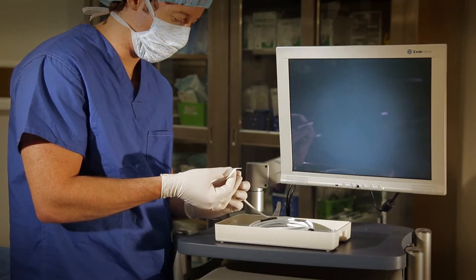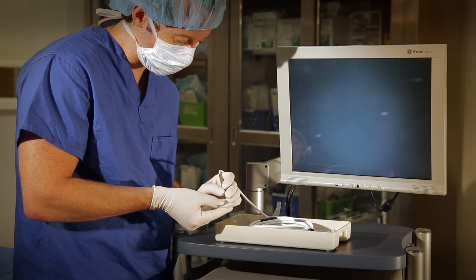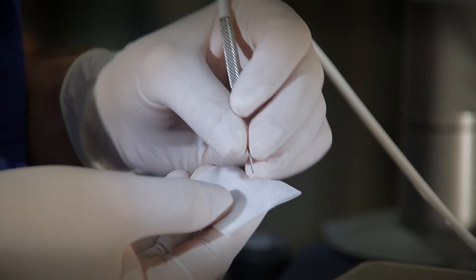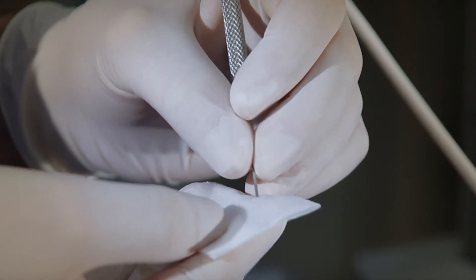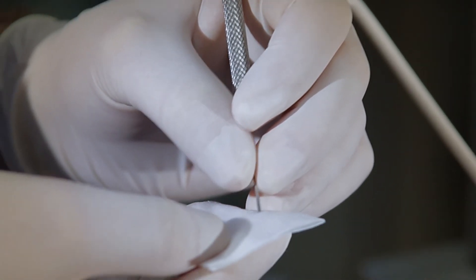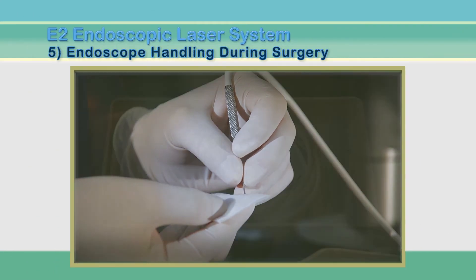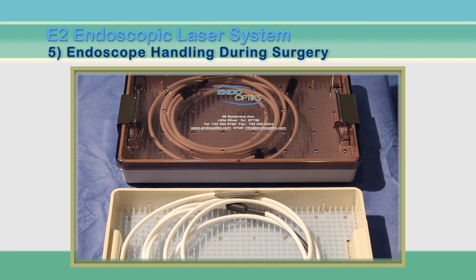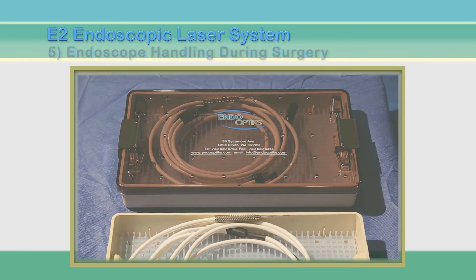A final cleaning of the tip is now performed using an alcohol towelette. These steps are necessary to remove all viscoelastic or tissue from the tip as soon as possible after use and before re-sterilization. It is always a good idea to have a sterile backup endoscope available in case something is wrong or questionable with the first.